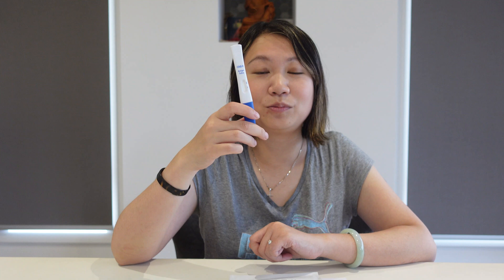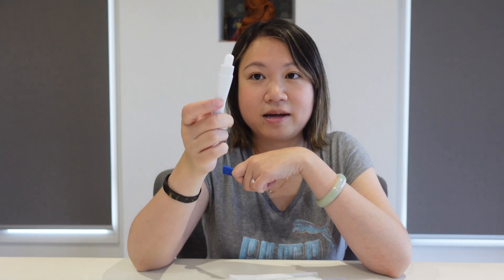Okay, time to try the test. First you need to take out the collection pad, which is this one, and remove the cover. This is what it looks like. And then place the collection pad and rub it inside of your cheek, on top of your tongue, and under the tongue. So I will show you.